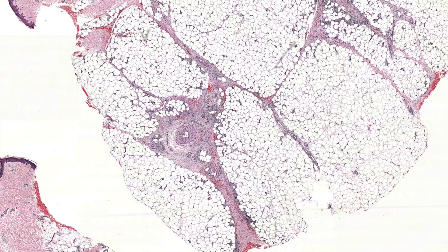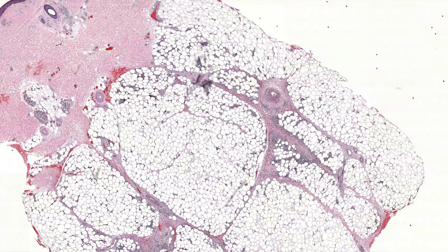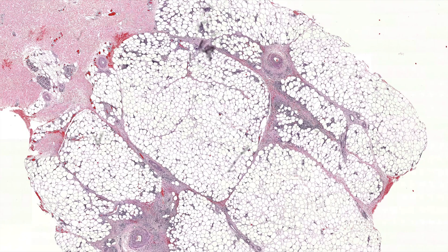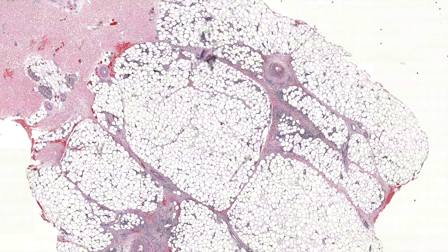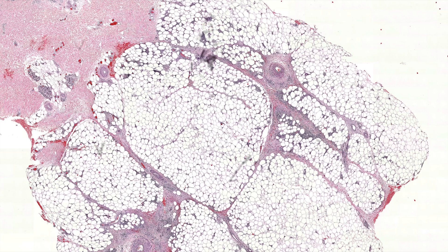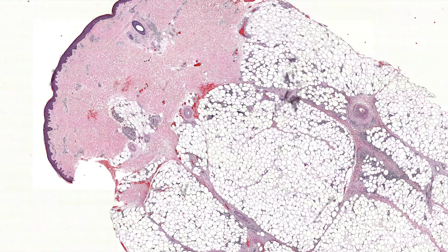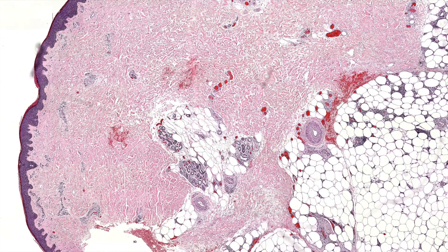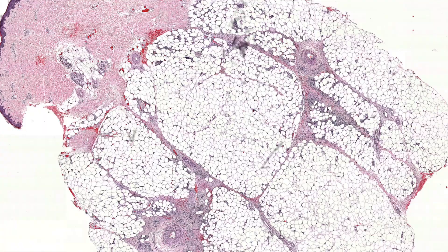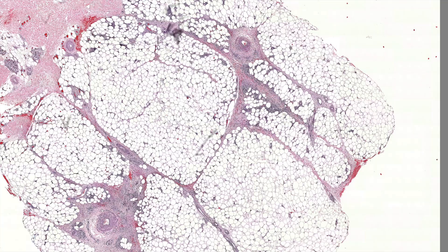From low power we can clearly see that it's okay to have some lobular involvement — lobular meaning in the middle of the fat. Most of the fat lobule here has relatively normal fat, maybe a touch of fat necrosis, a touch of atrophy, a little lymphocytic infiltrate, but it's relatively uninvolved. The septa is much more involved. If you didn't get very deep, you might suggest erythema nodosum clinically but it'd be hard to say for sure, whereas getting deep into the fat — either through an ellipse or a double punch — makes it a slam dunk.